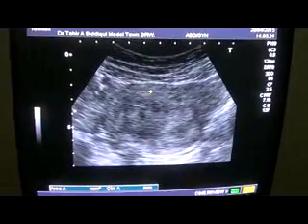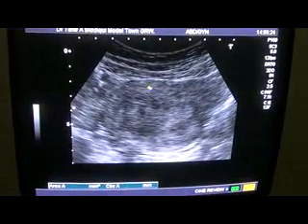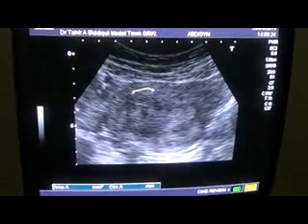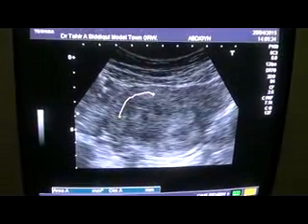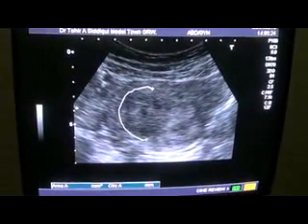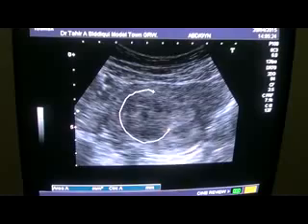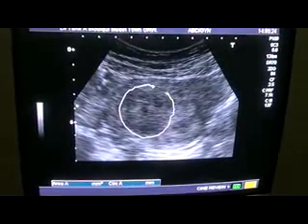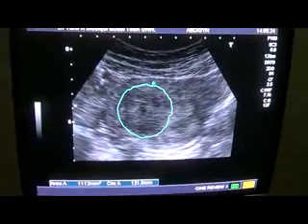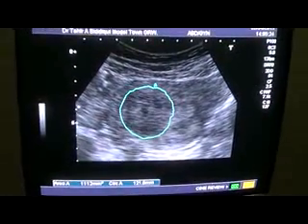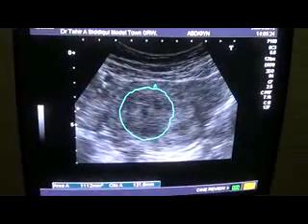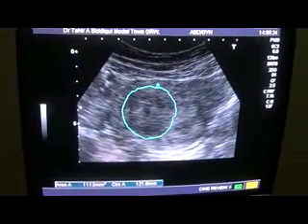This is the area of the solid mass, and this is the endometrial canal. This is our case of uterine fibroid with internal necrosis and a thickened endometrial canal.